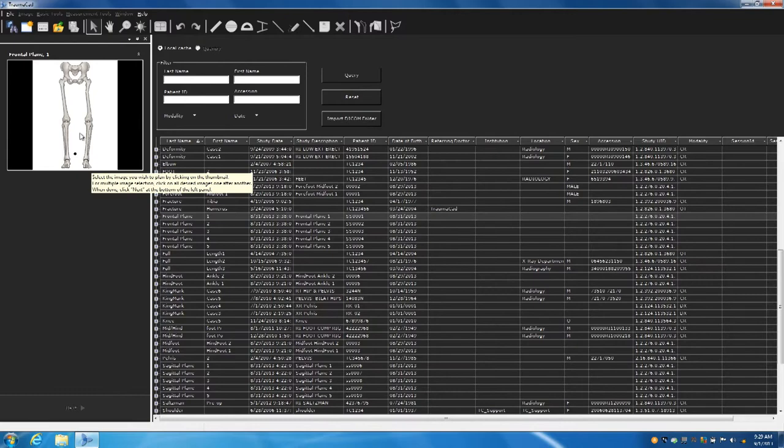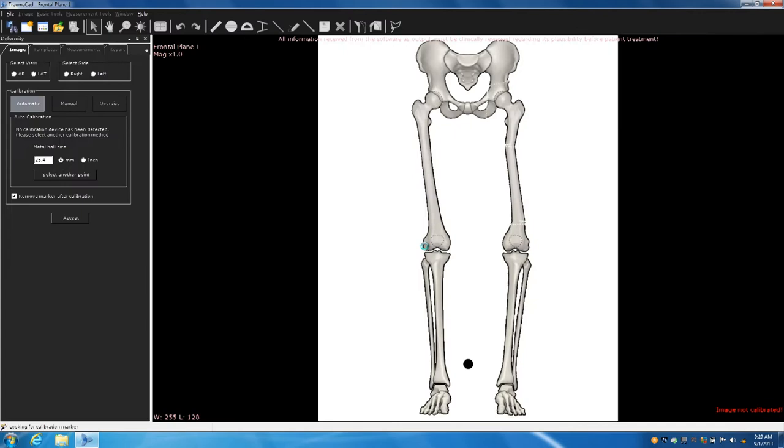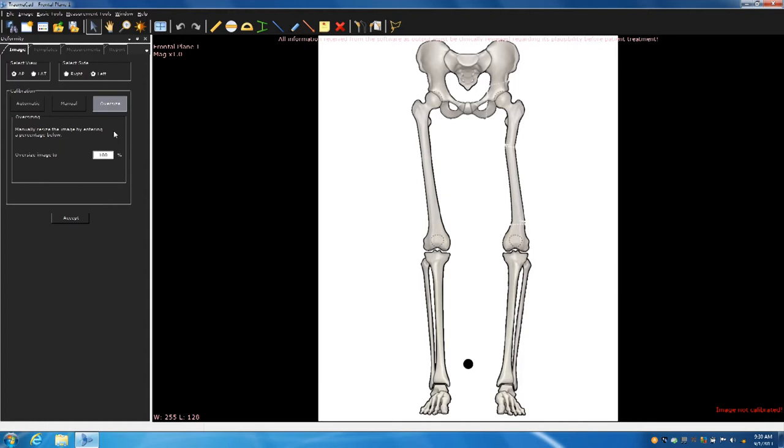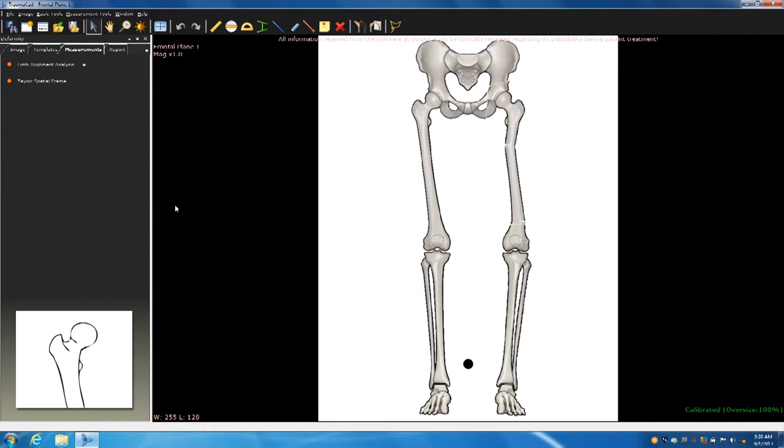Once you get this up on the screen, go over to the image and click on it. You then get to select the procedure, click on deformity, and it kind of enters. Now we want to select the side. Our side of interest, obviously, is the left, and it's AP. So AP left, or you can go right to left, left to right. Then it's going to ask you to calibrate. Typically the program will automatically select your mag ball. But since this is not a real image, it's a drawing, it doesn't see the little black dot. But that actually is a mag ball, 2.5 centimeters. To make it quick, just hit oversize. It'll ask you how to oversize, like Trevor was saying. Just hit accept just to go by.